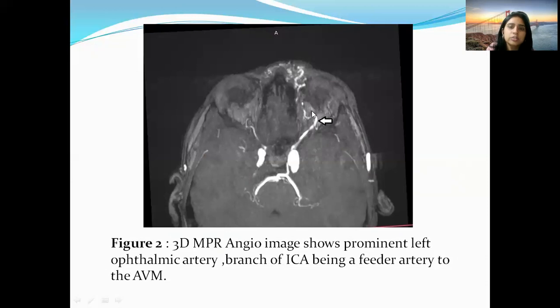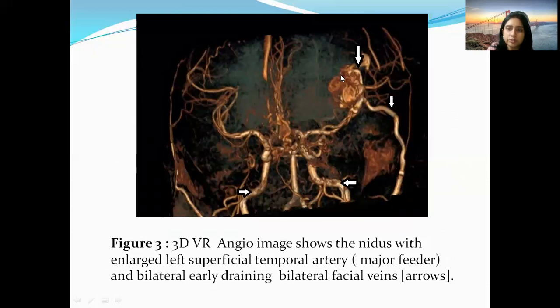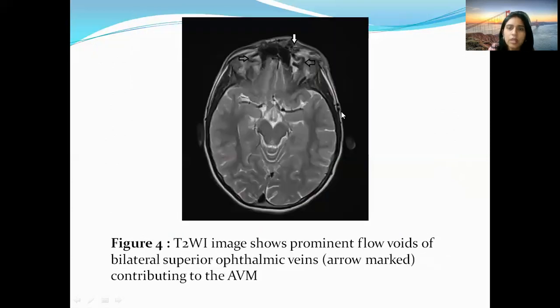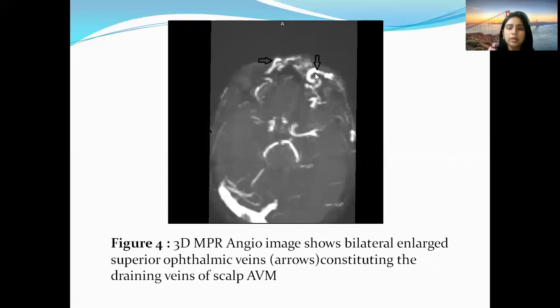The major feeder to this nidus is the left ophthalmic artery, which is a branch of the left internal carotid artery, contributing to the AVM. On the 3D VR angio image, the bigger major nidus is fed by the superficial temporal artery on the left side, which is a branch of the external carotid artery. The early draining veins are the bilateral facial veins, also constituting this AVM. The intraorbital component of the AVM shows bilateral superior ophthalmic veins giving prominent flow voids. On the 3D MPR angio image, bilateral enlarged superior ophthalmic veins are seen as the draining veins for the scalp AVM.